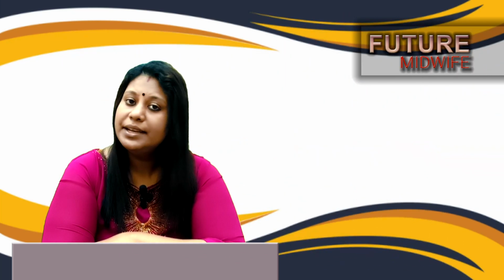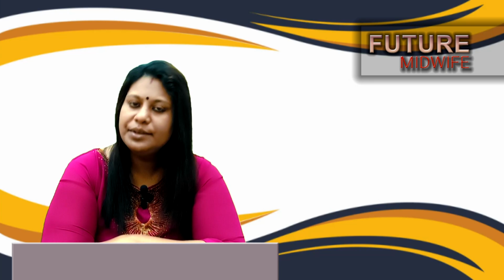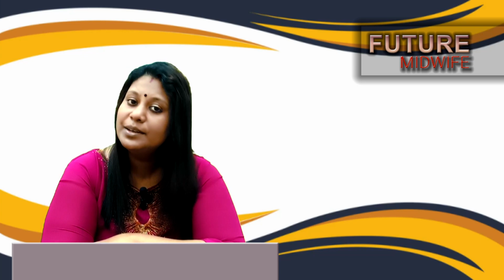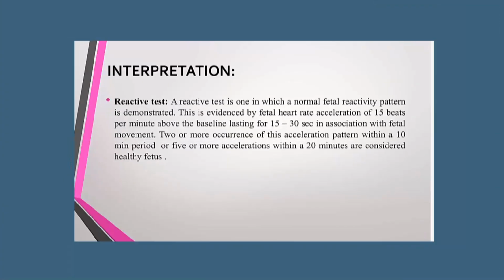Here we reach the interpretation of NST. In this interpretation we will get three results. The first is reactive NST, the second is non-reactive NST, and the third is unsatisfactory or suspicious NST. We will see them one by one.